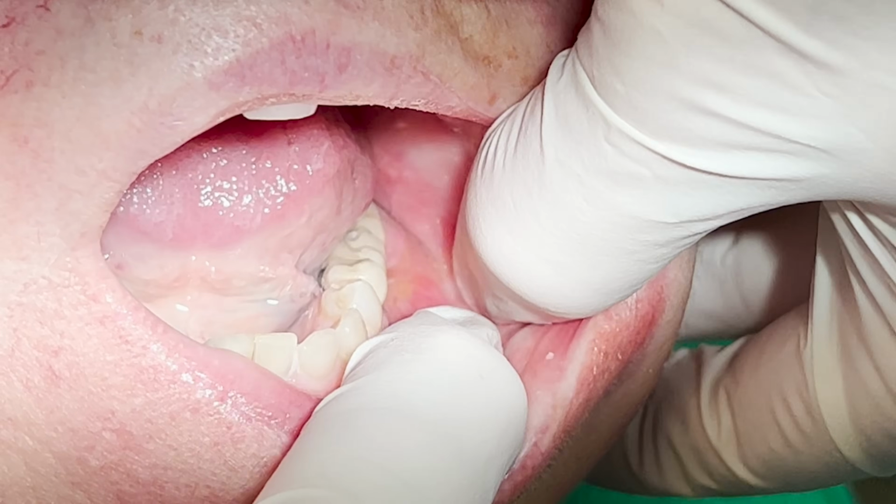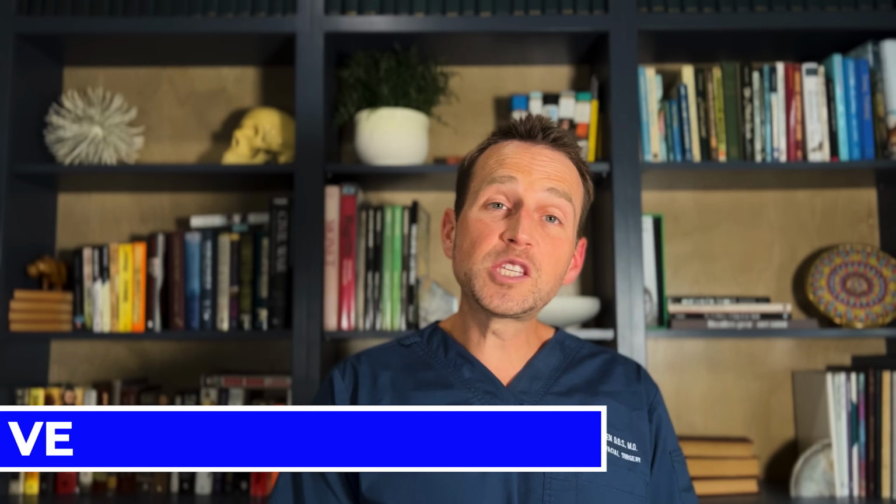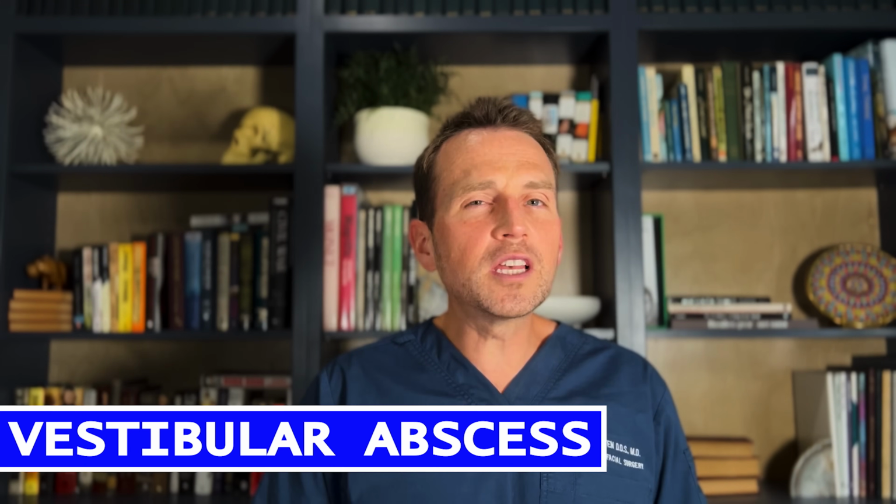I can visualize the swelling in the buccal vestibule, and it is fluctuant. This is a textbook vestibular abscess, something that can be treated in the office. Antibiotics alone are not enough to solve this problem because there is an abscess. The only treatment is an incision and drainage.